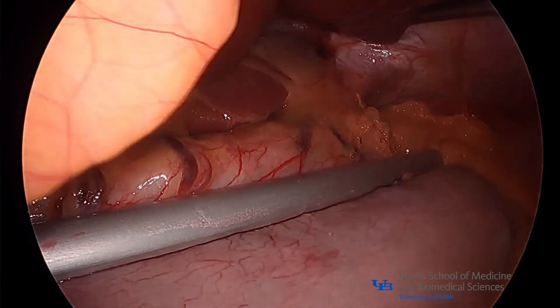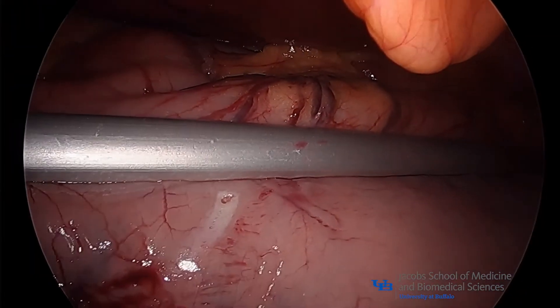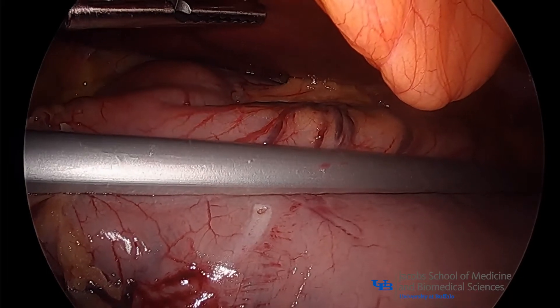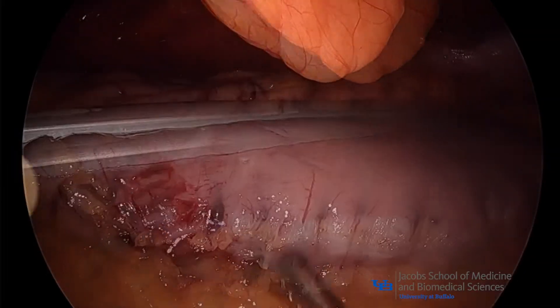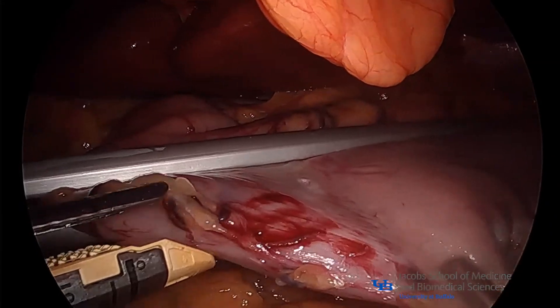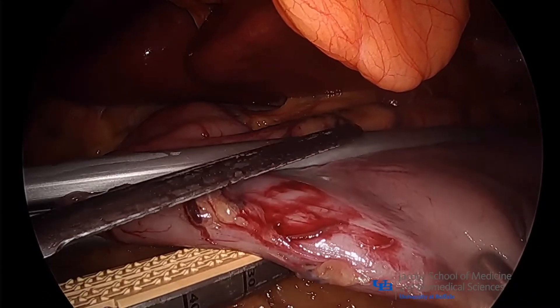The clamp is used to guide an 18-French OG tube along the lesser curvature of the stomach as it is advanced into the pylorus by the anesthesiologist. A vertical sleeve gastrectomy is then performed adjacent to the clamp.